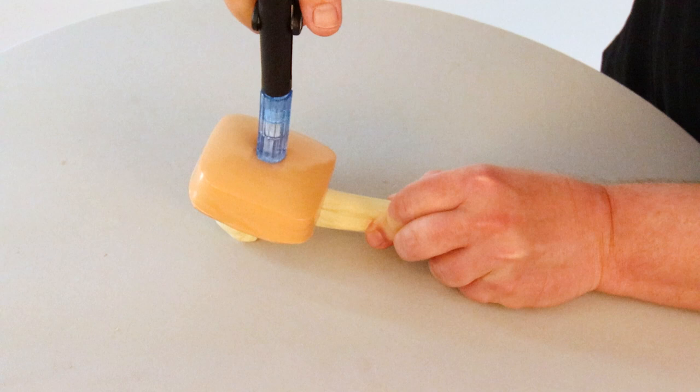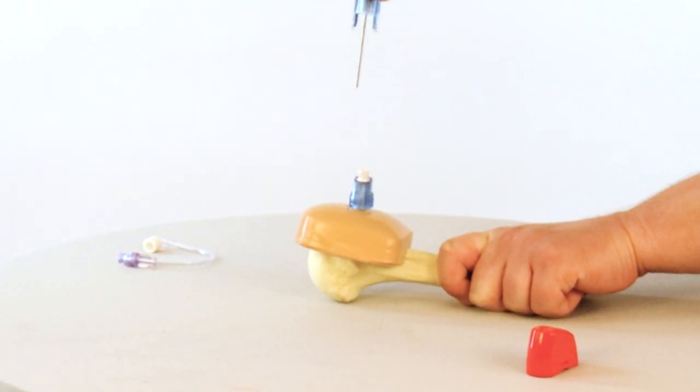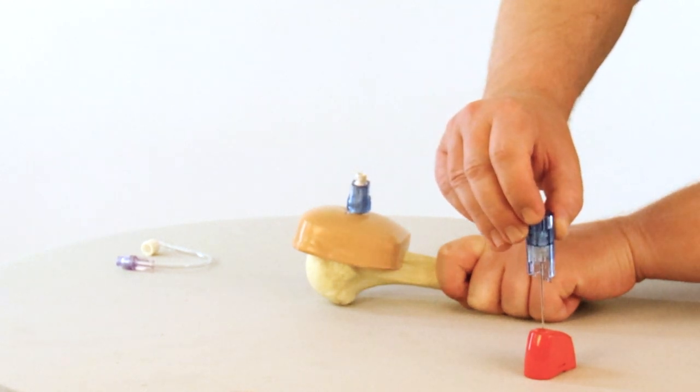Once needle assembly is properly positioned, the stylet is removed to expose a standard luer lock for extension set connection.